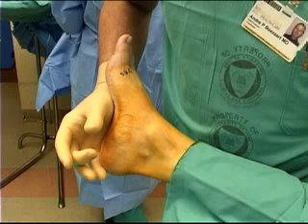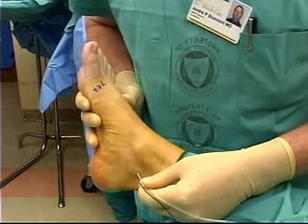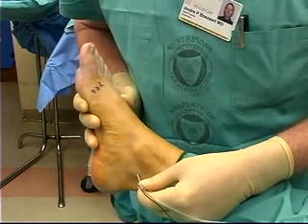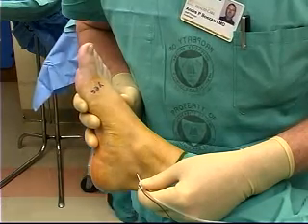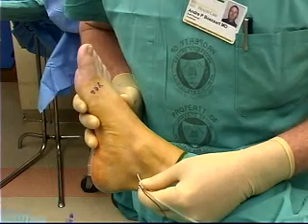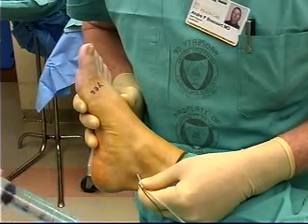If the artery cannot be palpated, the surface landmark of the nerve is usually halfway between the medial malleolus and the Achilles tendon. The skin and subcutaneous tissue is infiltrated with 1 to 2% lidocaine, taking care not to penetrate the fascia with a fine needle at this stage. A 22-gauge, 2-inch stimulating needle attached to a nerve stimulator set at a current output of 1 to 2 milliamps, 2 Hz, and a pulse width of 200 to 300 microseconds is used to locate the nerve. Toe flexion indicates that the nerve has been encountered.